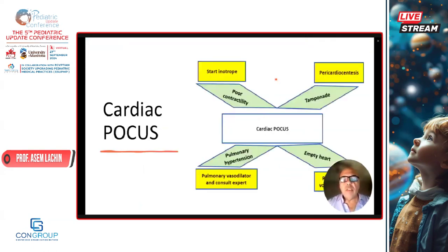Okay, so this is what we need to know about the lung. We are not going to discuss in detail the lung ultrasound and the scoring system. As we mentioned before, we are just looking for some specific diagnoses which can help us to figure out the causes of the crashed infant, and we can also help by following therapeutic measures based on those diagnoses.